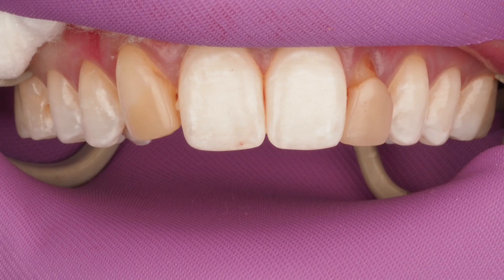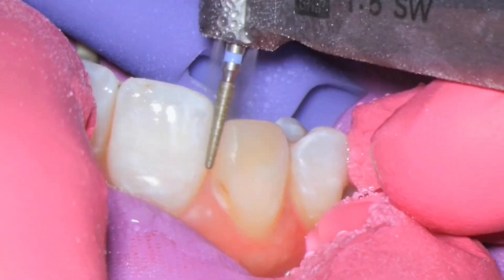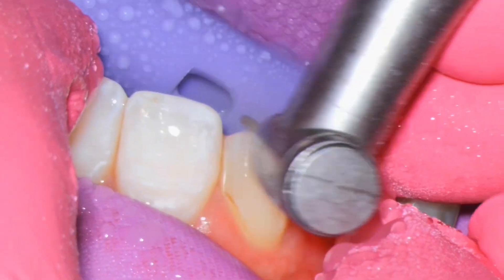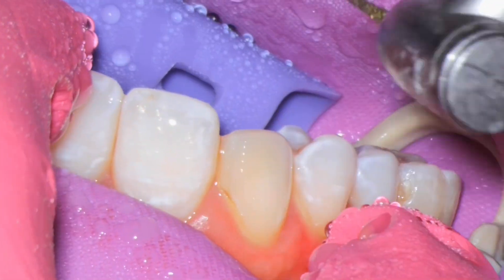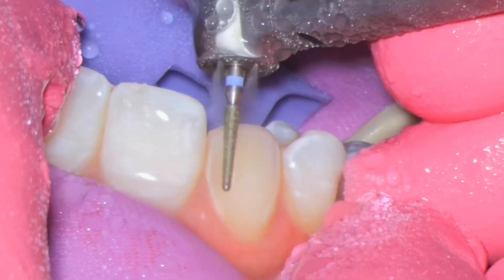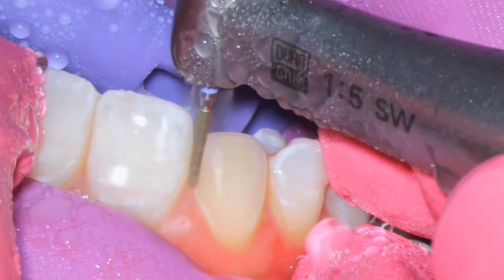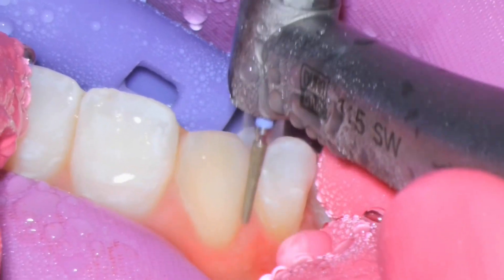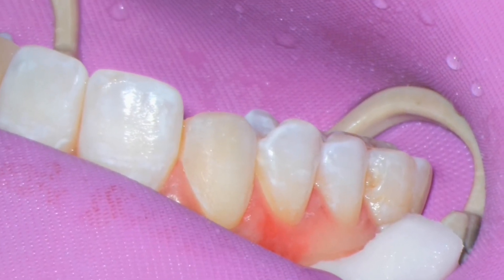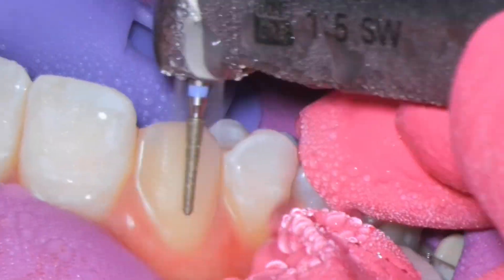This is not a no-prep veneer case because we're having to do so much. I take tooth reduction very seriously — I never want to reduce tooth unless I absolutely have to. The patient is just not interested in going back into ortho, and you can understand why after all those years. What I'm going to do is prepare that cuspid that is now in site number 10, and go ahead and break contact on the mesial, shifting that cuspid over just about half a millimeter to a millimeter without compromising the integrity of that tooth. I want to try to avoid going into dentin with my preparation.